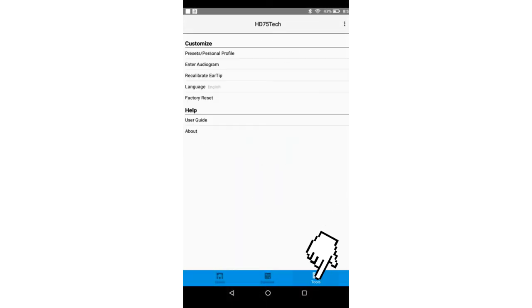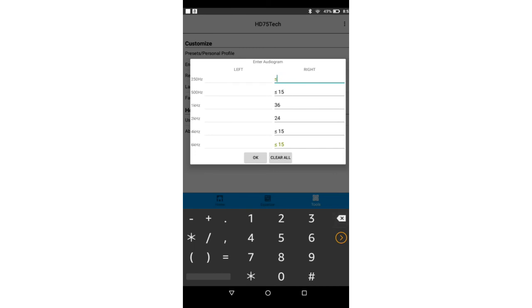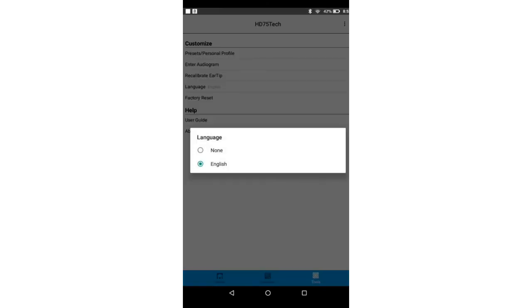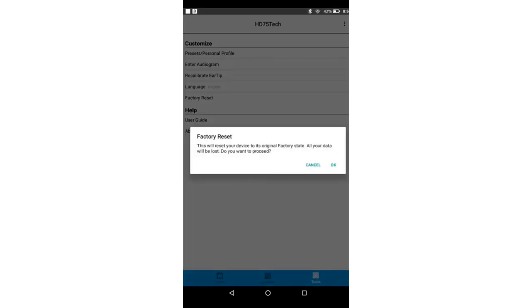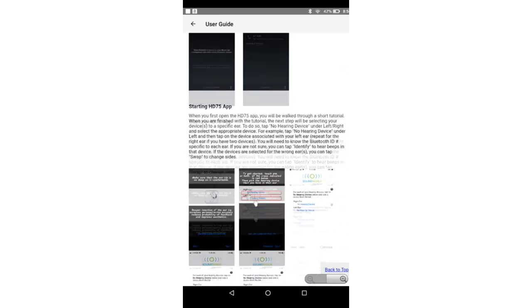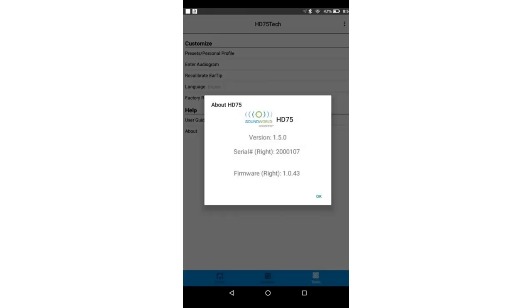Tools: the Presets Personal Profile option takes you back to the personalization screen. Enter Audiogram option allows you to enter audiogram information if the patient is coming to you with a recent hearing test — you can enter the values and the frequencies provided, which would replace having to run the hearing screening. Recalibrate Eartip is an option to use each time you change the eartip to allow the software to calibrate for feedback or whistling. Language default is English; more options may be added in the future. User Guide provides instructions on using the HD75 app and when to make changes to the environment modes and equalizer. About provides the HD75 app version, the serial number, and the HD75 hearing device firmware.